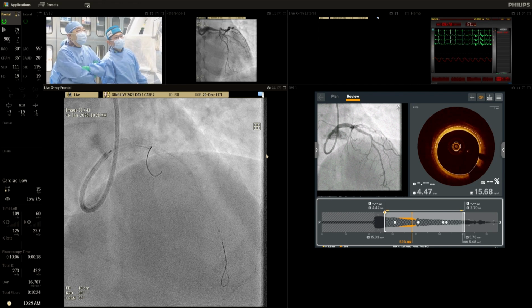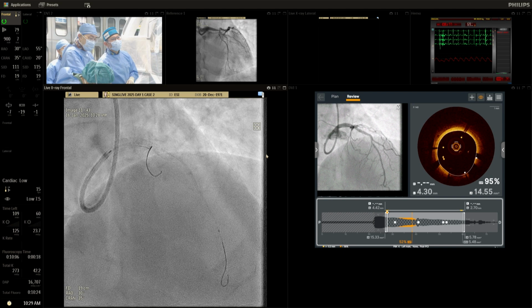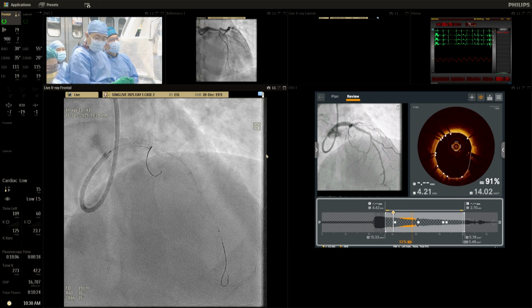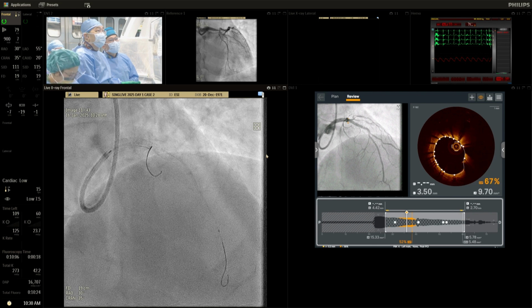So we're going to assess the stent. This is in the left main, going from proximal to distal. Here we see some stent struts hanging in the lumen. So either we missed the proximal edge of the stent when we were doing our POT, or quite likely when I was pulling the big balloons and the OCT out, the guider may have got sucked in and disrupted the proximal edge. So we'll go back in with the 5.0 to redilate that part.